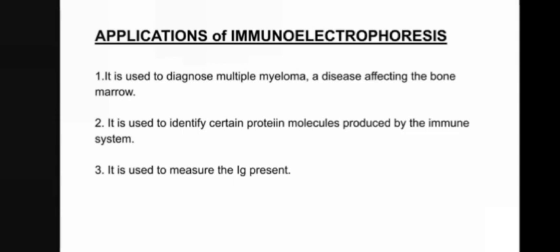Applications of immunoelectrophoresis. It's used to diagnose multiple myeloma, a disease affecting the bone marrow. It's also used to identify certain protein molecules produced by the immune system, and it's used to measure the Ig presence.